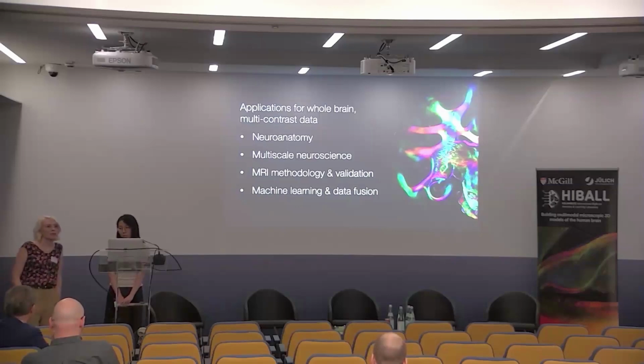So here we mostly do the tractography with isotropic resolution, and we just go down to 0.4. So you have one microscopy slide within that, and you have to think that that is representative of the whole voxel. What we can do is combine information potentially across the different microscopy slides, because all of them can tell you about fiber orientations, as the structure tensor and the PLI. And so then you would have a more dense sampling, but then you're mixing information from different sources, and there's a bit of a messiness to that in some ways. So that's not what we've shown today, but it's possible to do that.